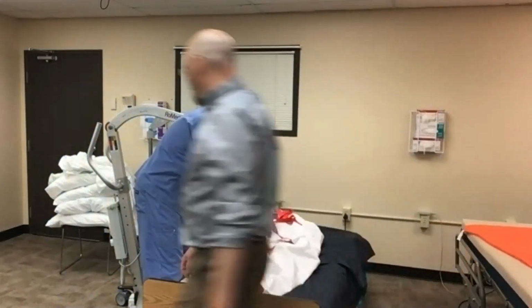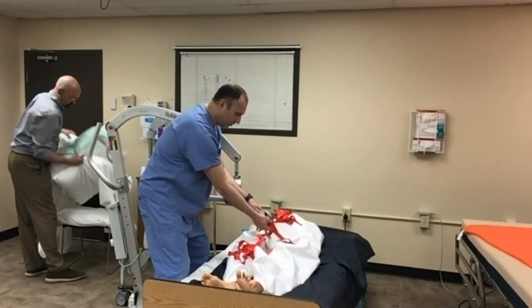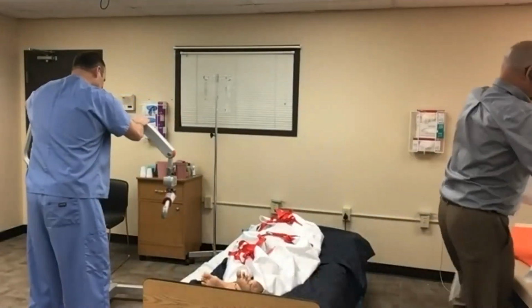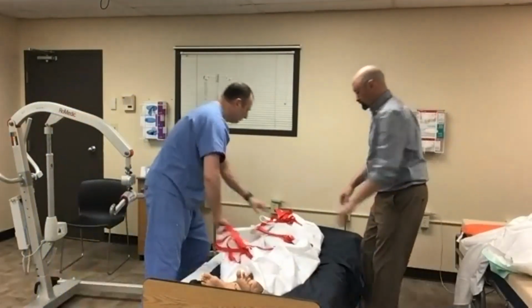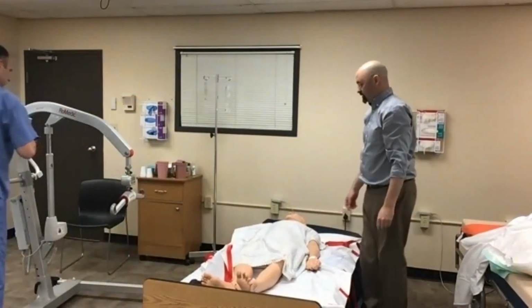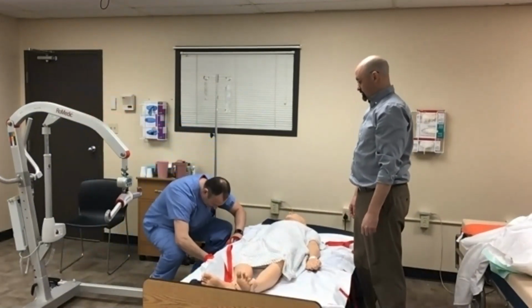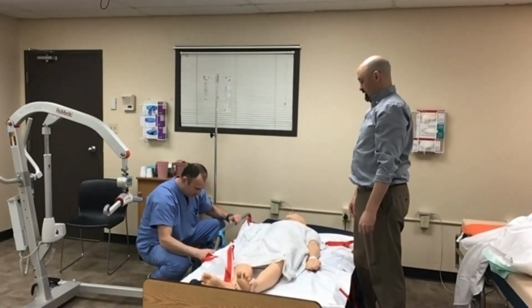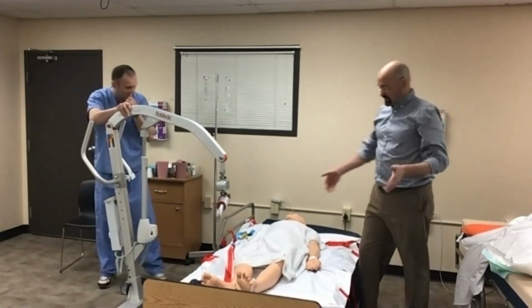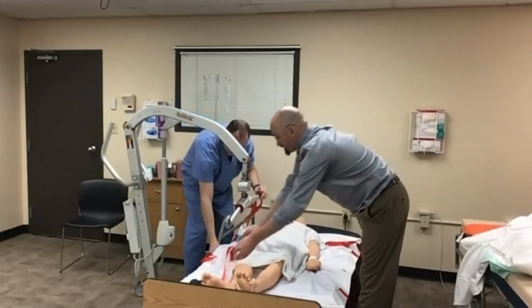As he's unclipping, we're going to get our pillows. Just so you can see how I'm getting this out, I'm going over the top, through the loop, and then it just slides through. We're going to put the handrail up on that side and bring our lift in. Now we're connecting that side. As with the air transfer device, if your patient is taking up this entire surface, you're going to have a very hard time proning him in this scenario.